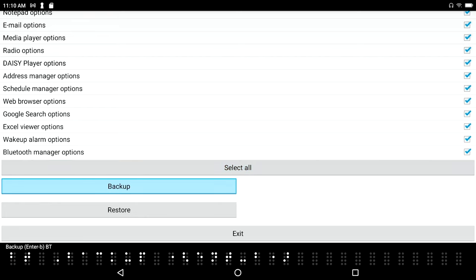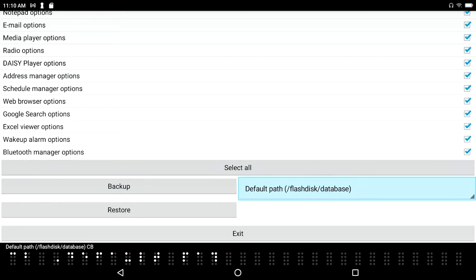Default path flash disk database combo box. I see flash disk database. I am on my Braille Sense 6, not the Polaris here, so this structure might look a little different to you, but the concept is the same. I'm going to press backspace to move up one level.